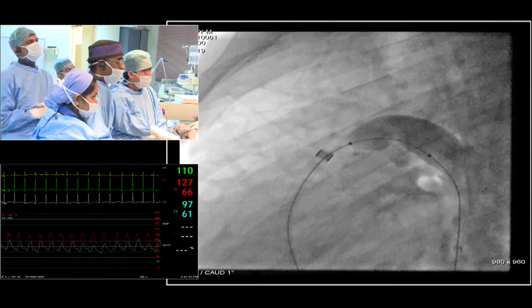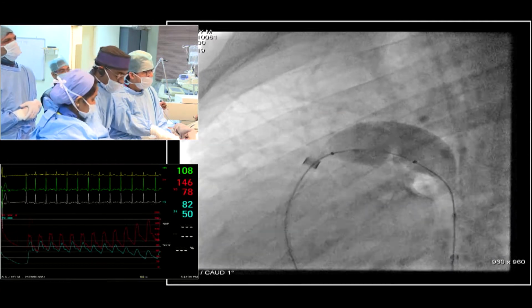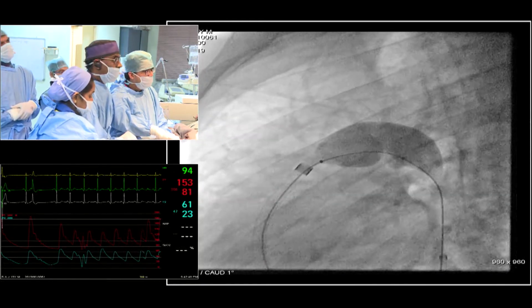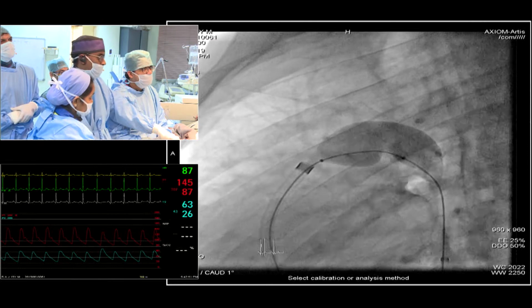What pressure difference would make you say, no, I should not close this? No, in any case, you need to close it because the duct is too big, but you have the option for Potts shunt physiology afterwards when you have a reduced duct, let me say, a communication.